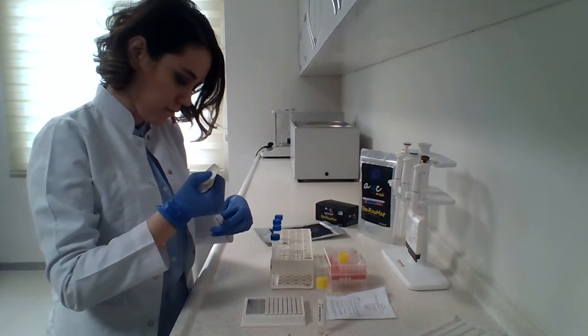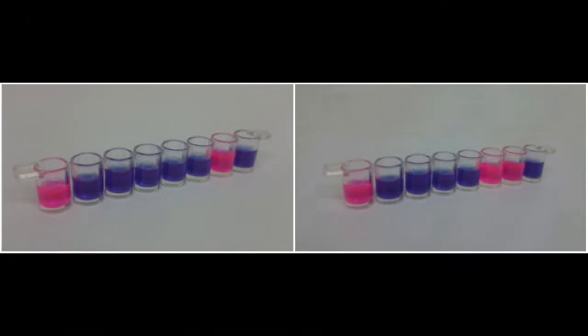At the end of 1 hour of incubation, it is easy to see the color change in wells by naked eye. The wells with bacterial growth have changed into red color. Wells with no bacterial growth have remained as blue. Accordingly, the last well without growth is reported as minimum inhibitory concentration.